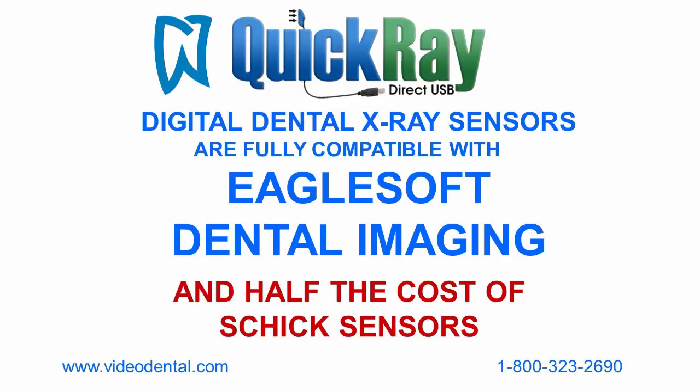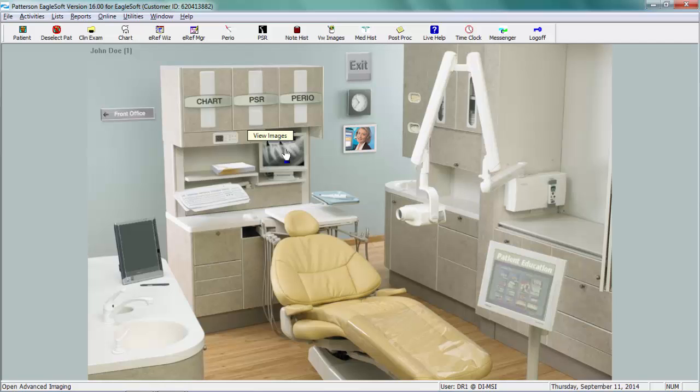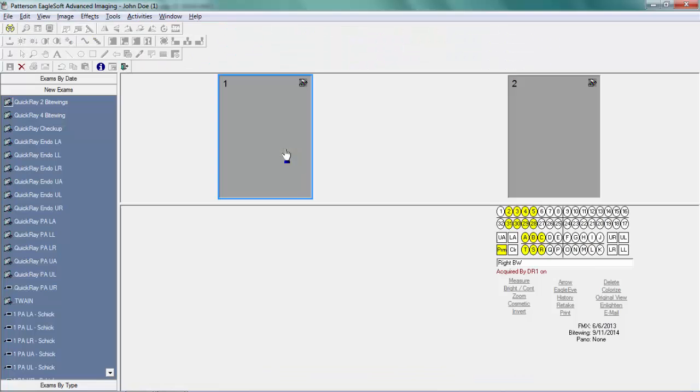Hi, this is Lee with Video Dental Concepts demonstrating QuickRay Dental X-Ray Sensors with EagleSoft Imaging Software. Choose a patient, choose an exam layout, and acquire an image.